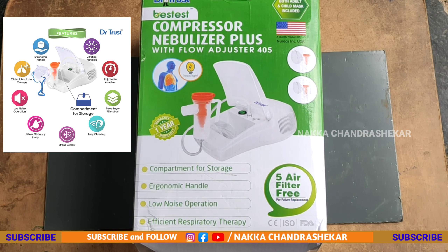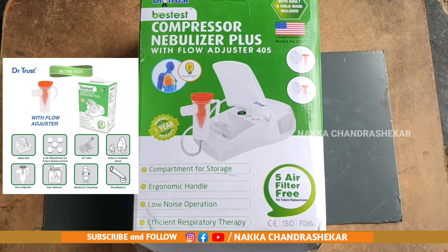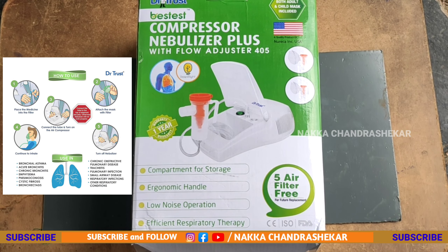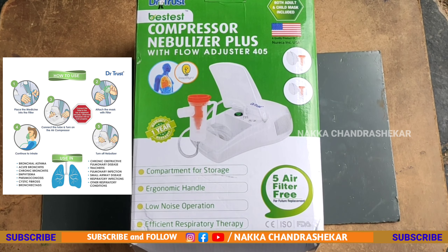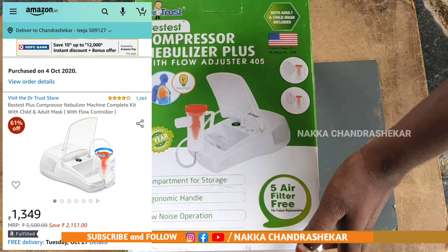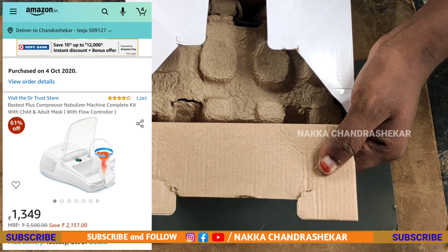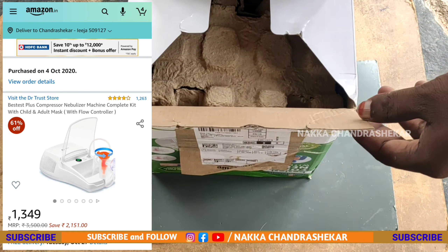I will show you this new nebulizer. I will show you the pictures — it was ₹1,349. It was a big package.